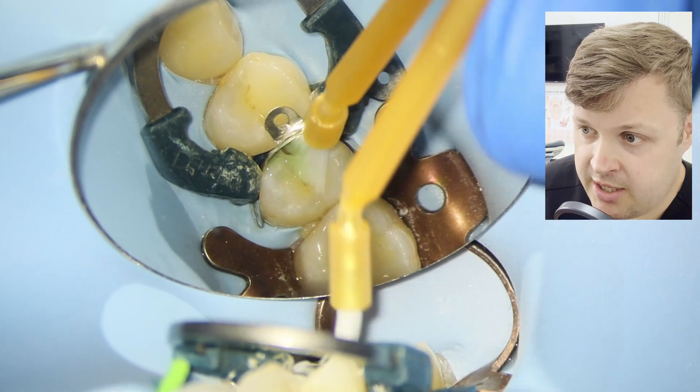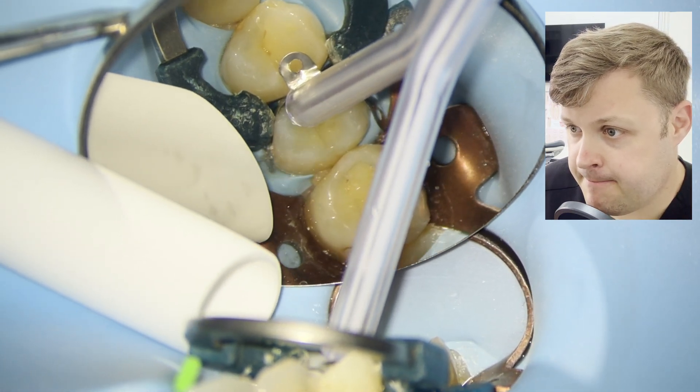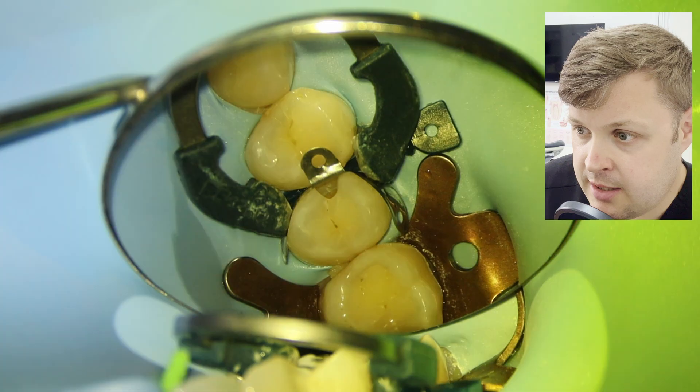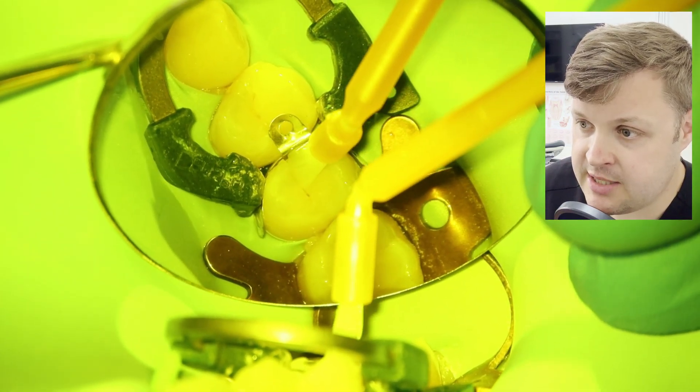We're going to agitate the etch and then wash it away — all nice and clean. Then we're going to use a normal bond; I believe this is i-Bond.